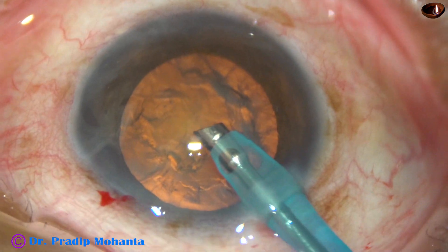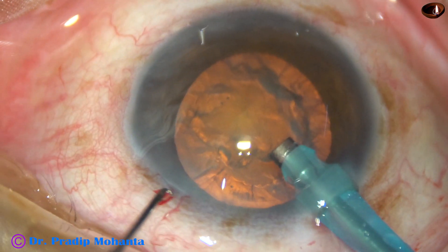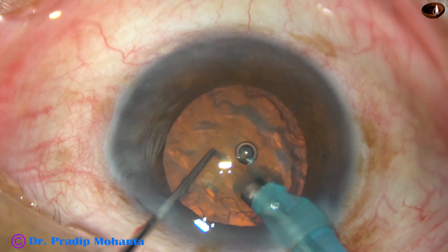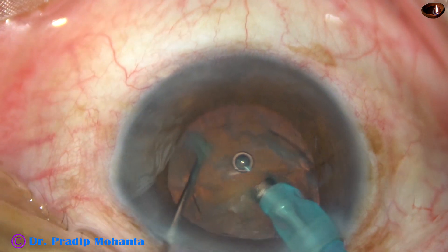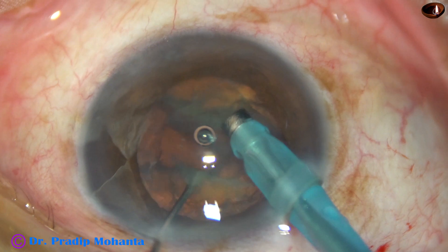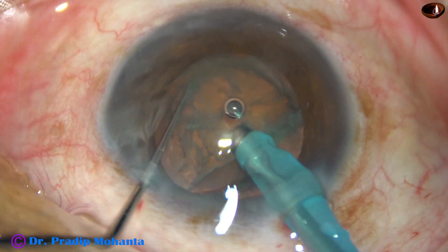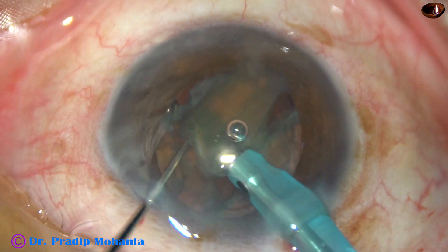After rhexis, hydrodissection, and nuclear rotation, the tip of the phaco needle is introduced into the anterior chamber. Here, some superficial cortical lens matter is aspirated for better visibility. And now, a small pit is made just in front of the main incision. The tip of the phaco needle goes into the floor of that pit and supports the rest of the lens mass.